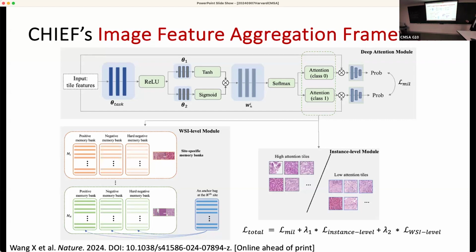And at the end, we train a model based on multi-instance learning. This is largely because within the same whole slide image, here we only ask the pathologist to identify the final diagnosis for the entire set of samples, without specifically labeling which part has the tumor tissue and which part does not have the tumor tissue, and just being identified as adjacent normal samples from the same patient.